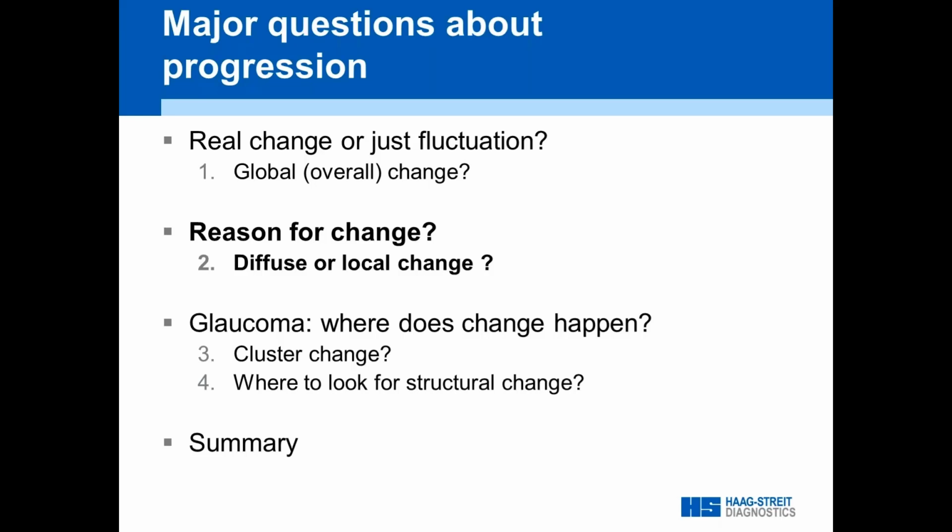I mean, we do have normal values for the MD, and if you look at a single MD, and it goes beyond the normal ranges, you get an orange and a red color code saying it's outside of normal ranges in the newer software version. But on the trend analysis, this is not relevant. What we're looking at is how likely is that kind of change happening in a stable series. And we use statistics to do that. And if it deviates too much from a stable trend, then we say this is progressing.